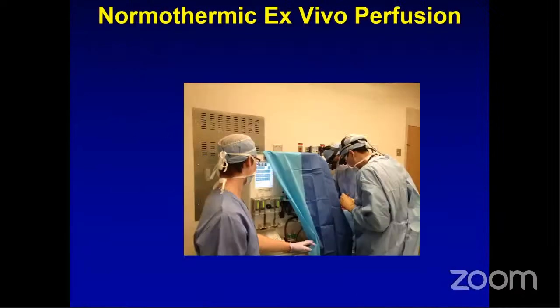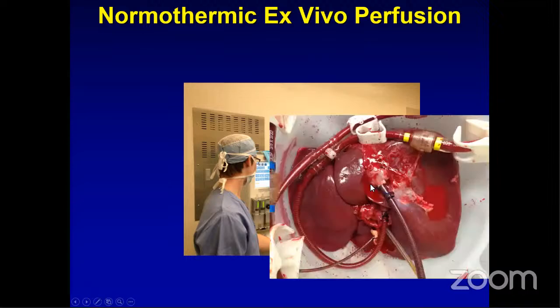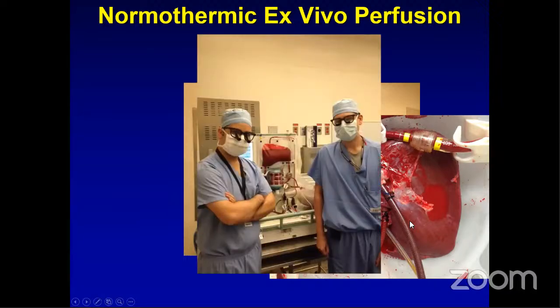And this is something we do in Toronto also. This is the Organox machine, and you can see our fellows working here on the human liver before implantation. So this is now done in clinical practice for human transplant. There's a perfusionist watching the machine parameters, and our team is connecting all the things. This is how the liver looks when it's on the pump. So it's a liver out of the body, now perfused. You see that the arterial line has a brighter color than the venous line, indicating oxygen supply. Our team likes to pose afterwards for successful cannulation.